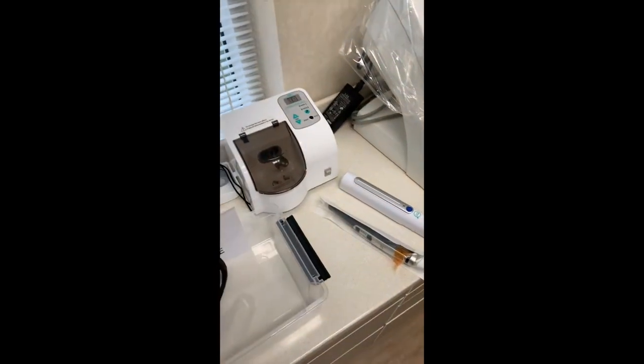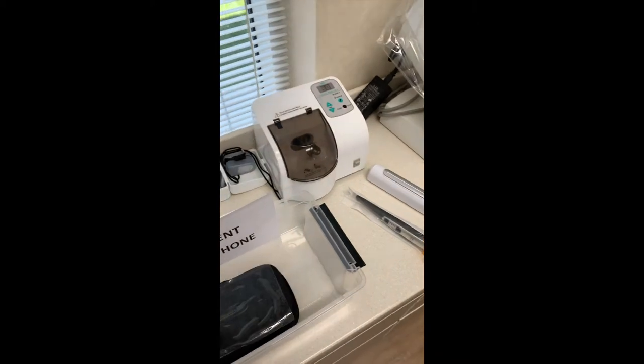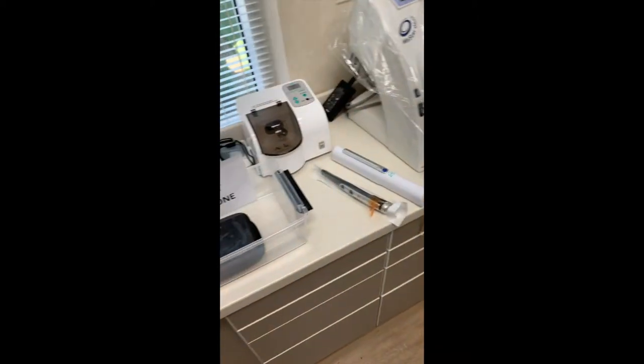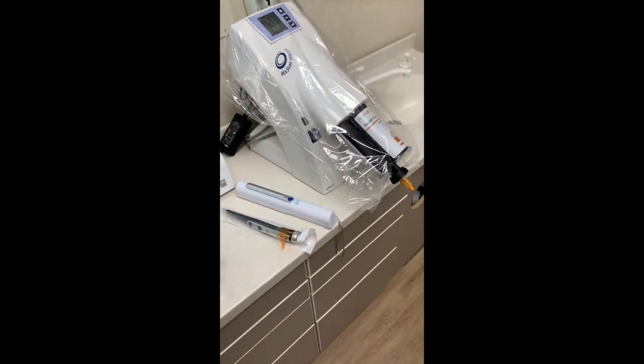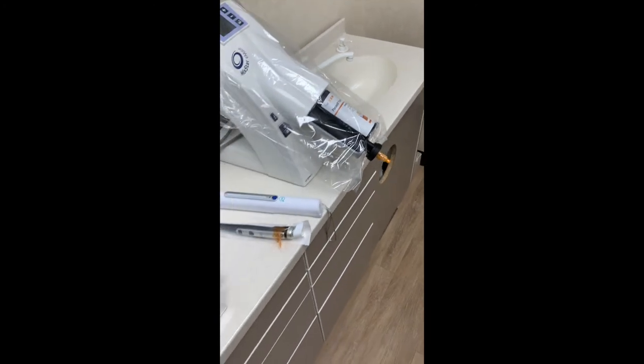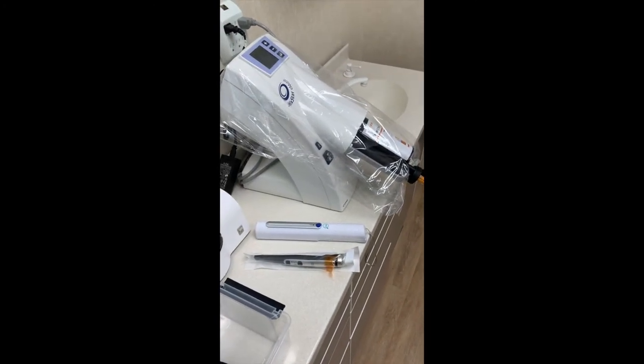We have a patient cell phone caddy, which is a UVC device to sterilize their phone while they're waiting and having their appointment. You can see plastic barriers on pretty much everything, and another UVC device to help clean countertops afterwards.